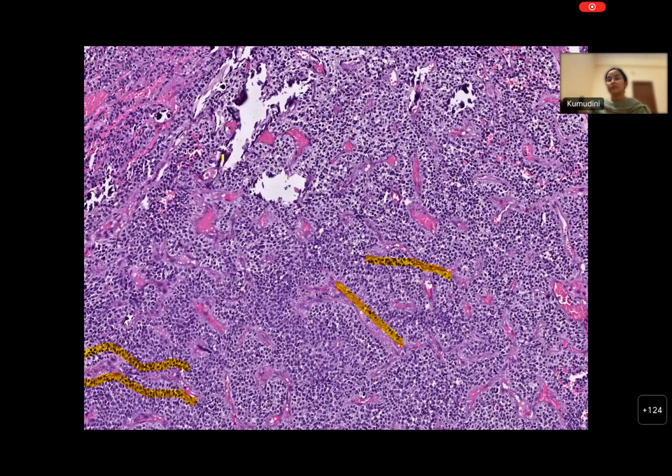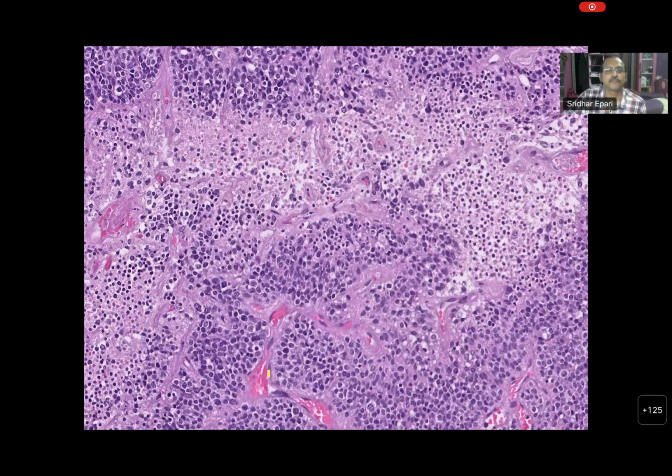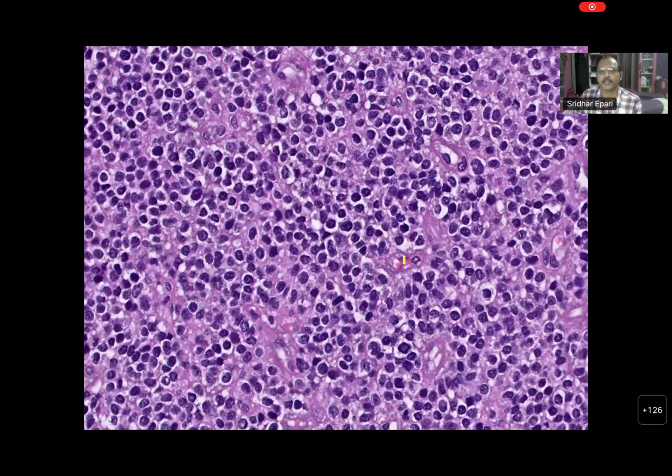How do you say this? Sir, the tumor cells have round nuclei and clear cell change, with perinuclear clearing, a halo. What are these areas? Necrosis. So a cellular packed tumor with areas of necrosis. Anything different in this morphology, in this slide? The same perinuclear halo, right?